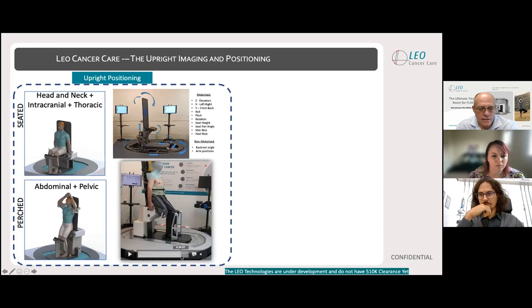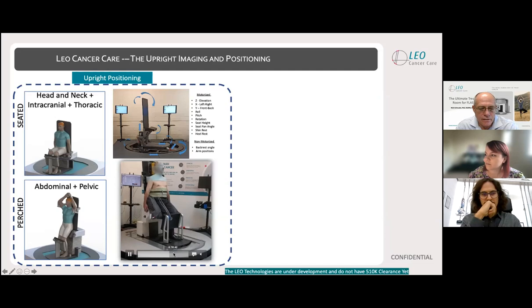You can see the device can rotate around the vertical axis, and it can be extremely precise with a very smooth motion. I was sitting in this device the other day, and when this motion occurred, like rotating up and down, you absolutely cannot feel that you're moving.